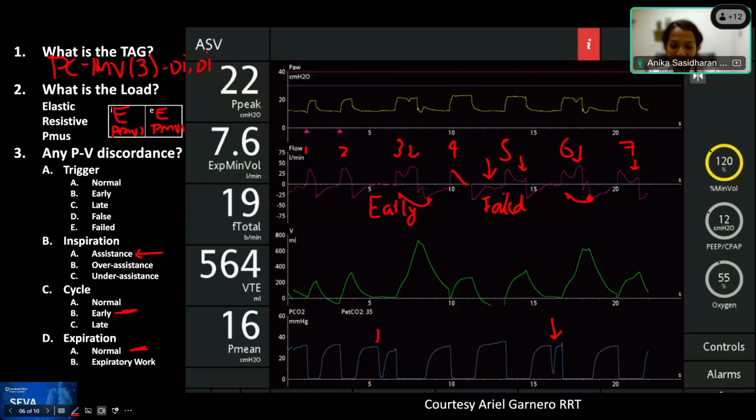Rob, anything to add there? Yeah, again, anything you do on the ventilator is guided by your goal, right? So if the goal was comfort, then as Ariel suggested, you might just go to pressure support and wait for the patient to start triggering the ventilator. But if you are at marginal blood gases to begin with, and you wanted safety primarily, you might go to PC-IMV2, right? Which means that if you could drop the mandatory rate intentionally, then hopefully the patient would pick up the spontaneous breaths.